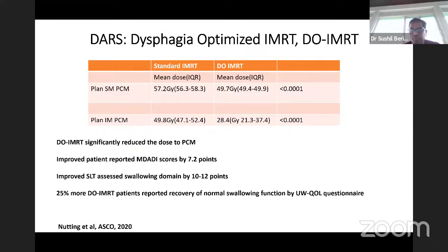Good. So Eric, we can open up the forum for the questions, and in the meantime I can answer that. So from GTV to CTV, it varies. Some said 5 to 10 millimeter, but 5 millimeter was for the highest risk and 10 to 12 millimeter for the lower risk. So it's different depending on what you're talking about. If people say CTV to PTV is 3 to 5 millimeter, it all depends on what imaging you're using and how frequently you're doing the imaging.